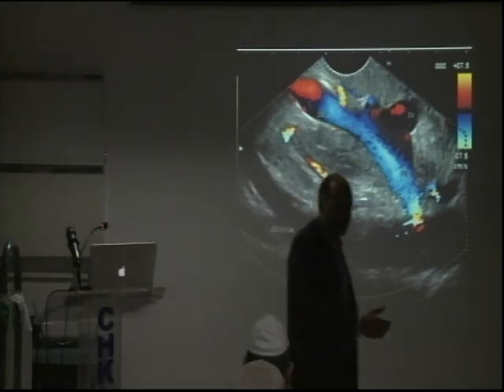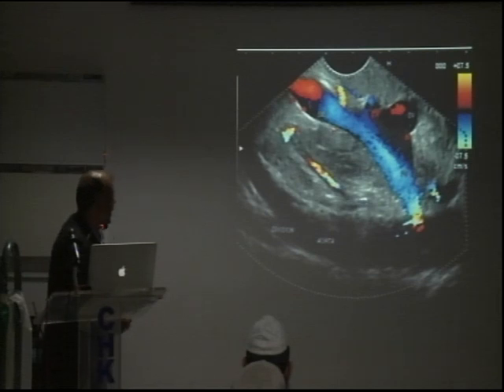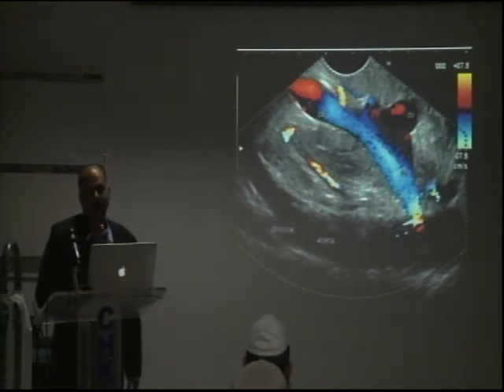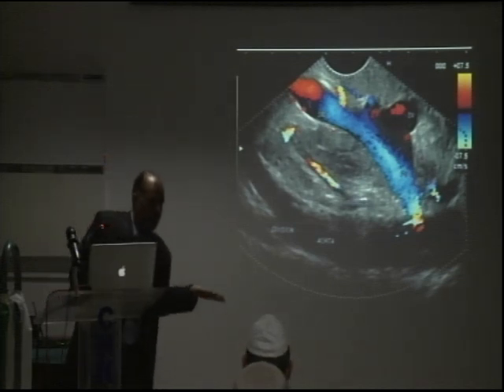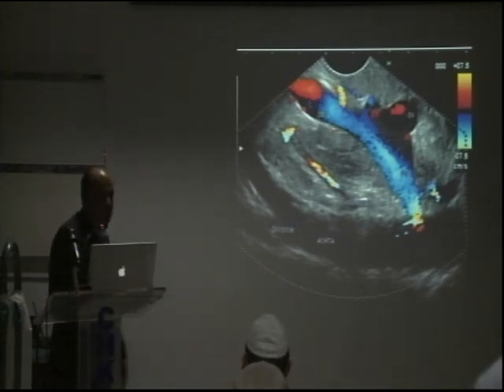Any idea? This is what I wanted. Why is this coming from here and then going like this? The portal vein and the splenic vein should be coming like this and going up like this, isn't it? That's what your anatomy should tell you. That's what should be logical. Okay, so the transducer is always on the top. But when you are in the patient, the transducer is always changing position, isn't it? But on the picture, on the EUS, it's always in the same place.